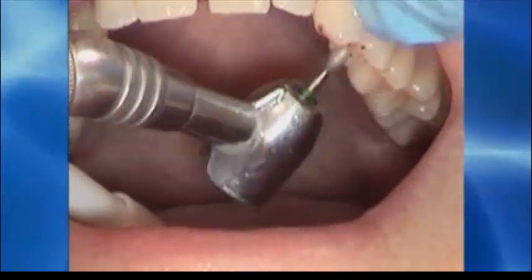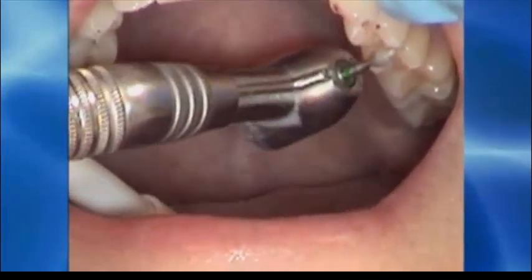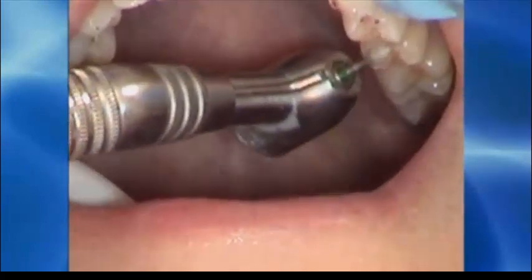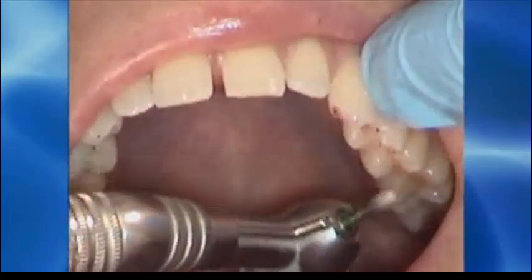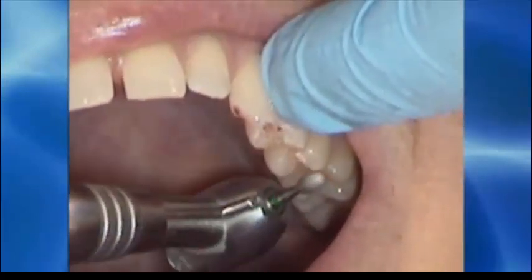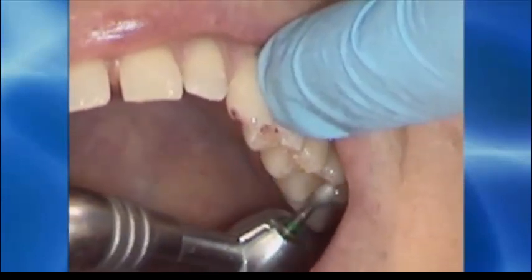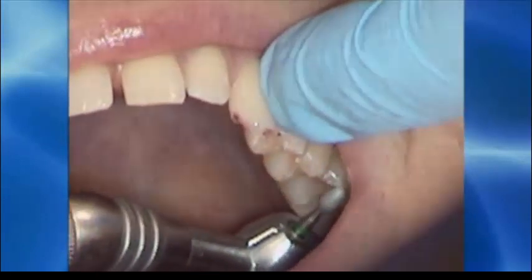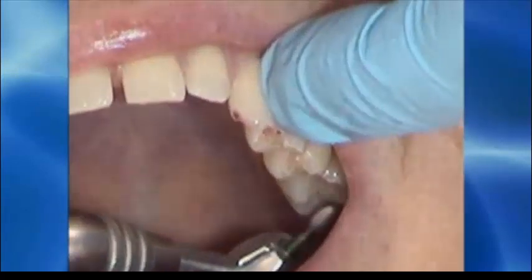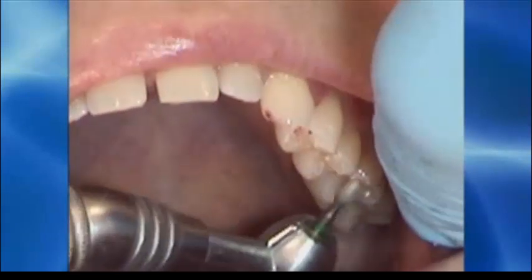To reduce the disclusion time, it's necessary to treat the inner inclines of both the premolars and the molars where you see the linear articulating paper markings. Here you can see I'm working on the mesial aspect of the first molar and the central fossa of the second premolar. Here I'm working on the inner aspect of the second premolar and the inner aspect of the first molar on the buccal incline, removing that line that goes out towards the buccal from the central fossa.